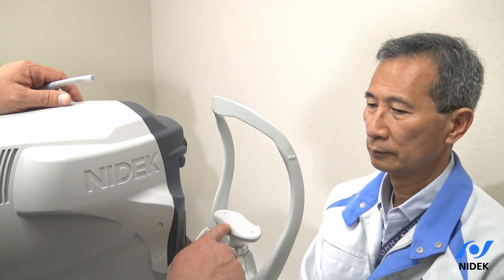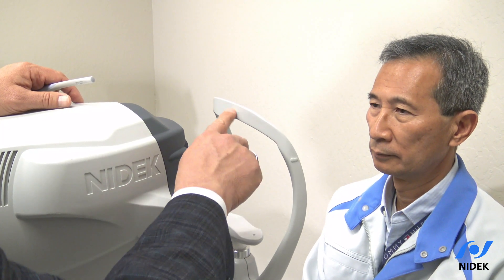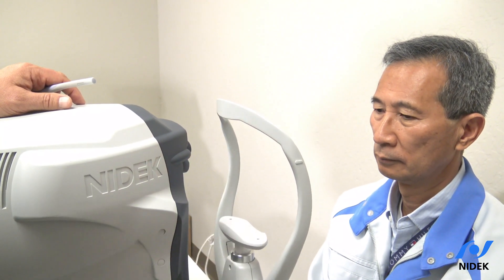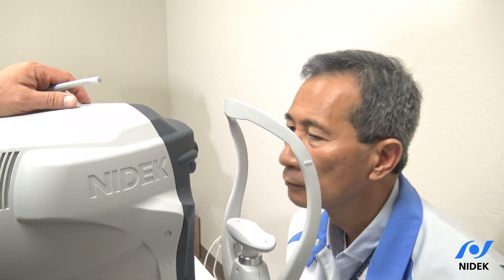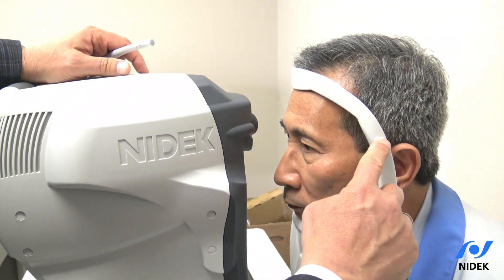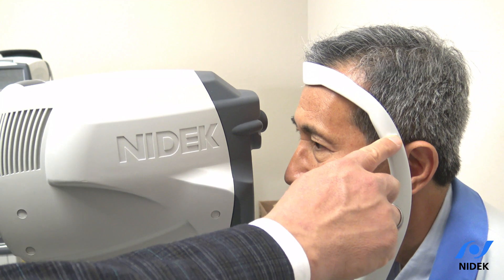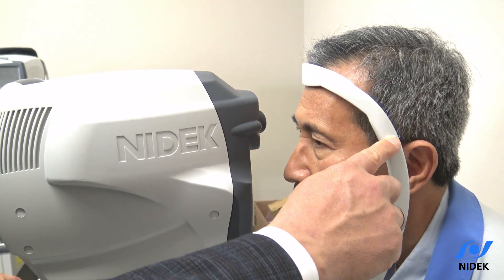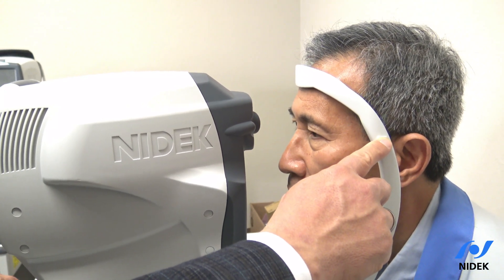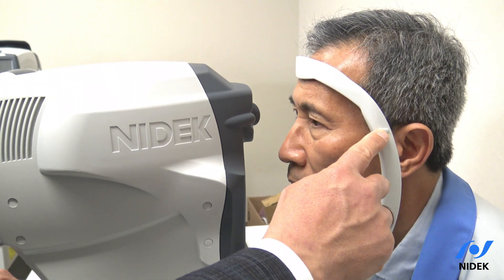Place the patient's chin in the chin rest and forehead against the forehead rest. This is your lateral canthus marker. We're going to bring the patient's chin up or down to match the lateral canthus marker.